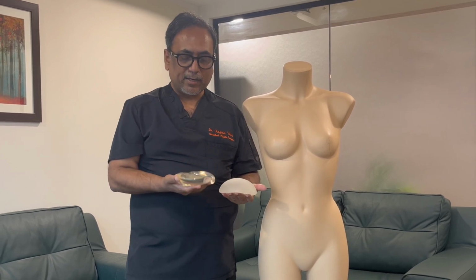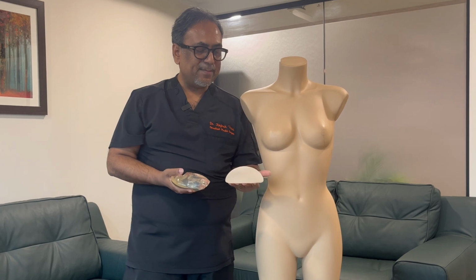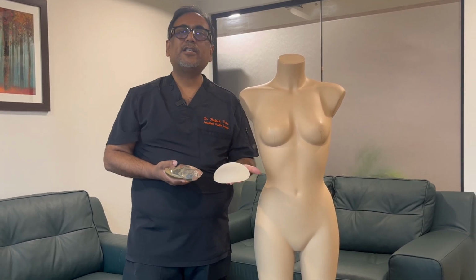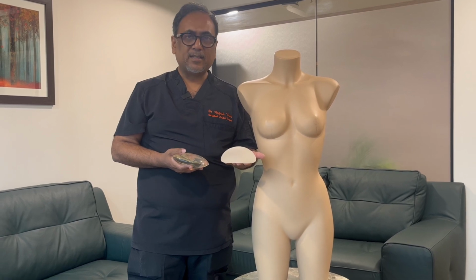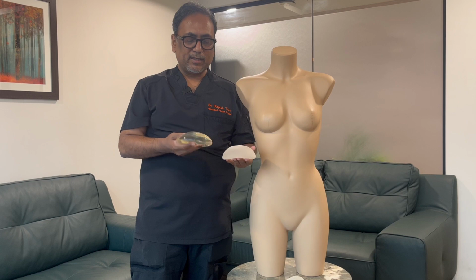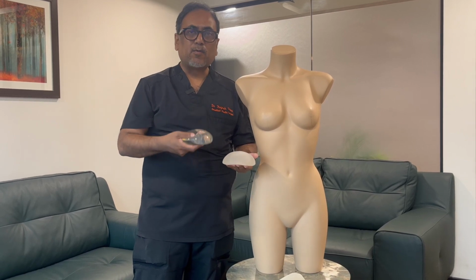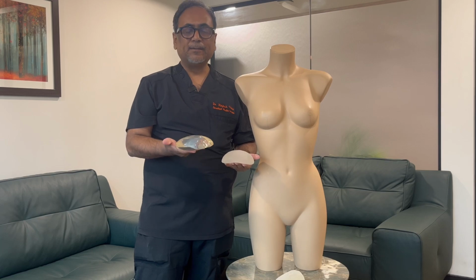So we would use a silicone round smooth implant like this, and textured implants have some amount of association with breast implant associated anaplastic large cell lymphoma. So textured implants are getting out of vogue for the simple reason that the chances, whatever little, are very less with the smooth implants.